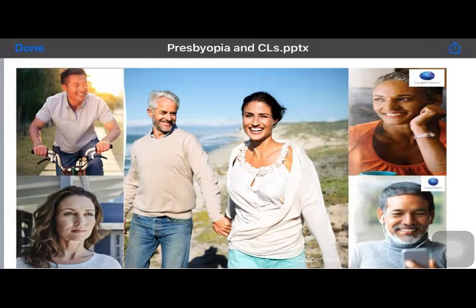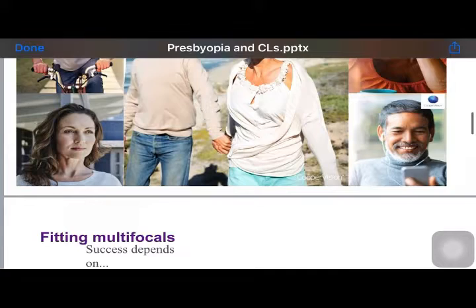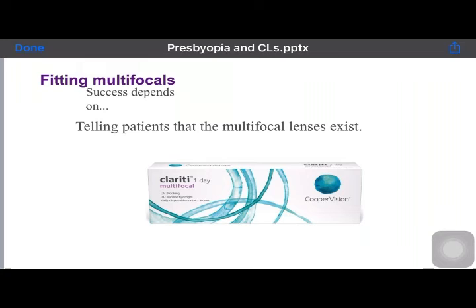As an active lifestyle. So that is how our presbyopes would require the dual correction of both contact lenses and specs. And so the success of multifocal lenses will depend on telling your patient that they exist. Because if you don't tell them, they will not know. If you tell them, they will know and they can make a choice decision whether they would like to go for multifocal lenses or not.